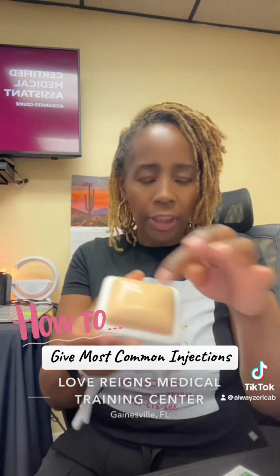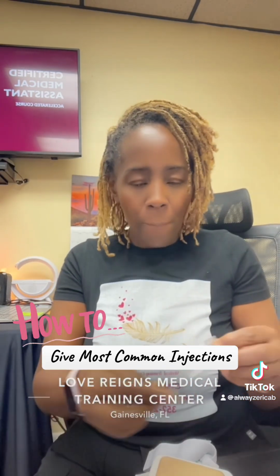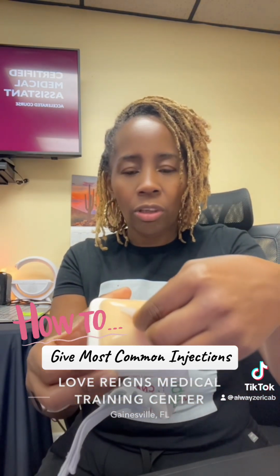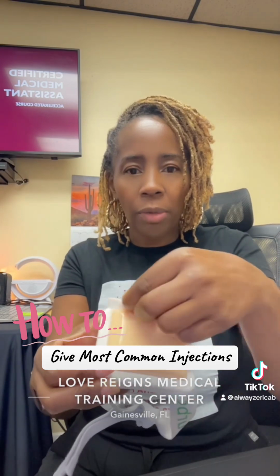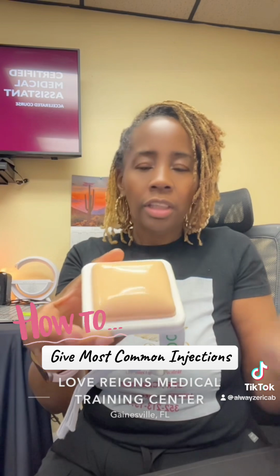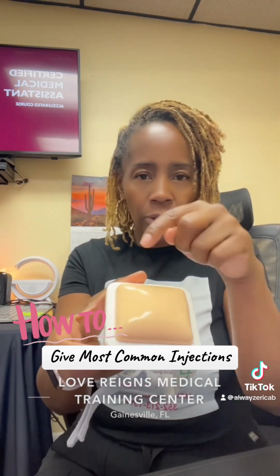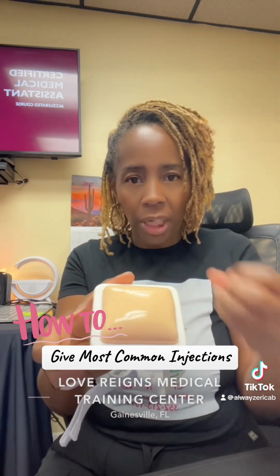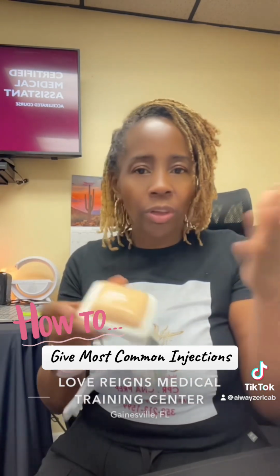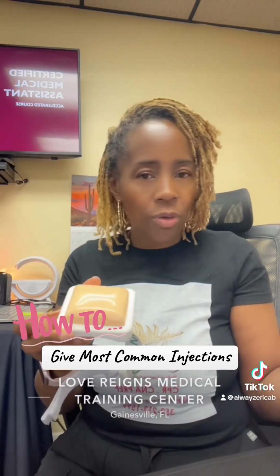For the most part, you're going to clean that site with alcohol. I want you to understand too that with alcohol, you want to start from the site of insertion and go away from it, out, and never come back, because what you don't want to do is bring dirty to clean, okay? So once I clean that middle part, I'm going to go away from that site and never come back to that site. And you want to let that air dry. We don't do this anymore. We're not waving it dry. You're going to let that air dry, okay?